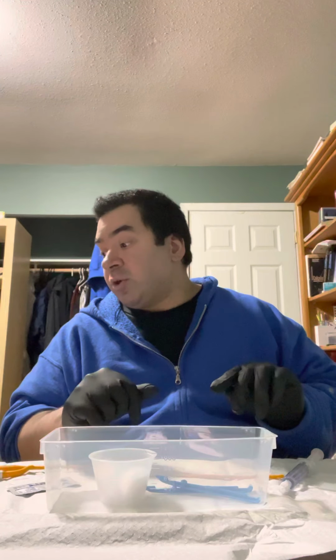I will not force the catheter if I feel resistance or if the patient feels any discomfort or pain. I will ask the patient to take slow, deep breaths to promote relaxation. If I have difficulty advancing the catheter, I'll hold it in place to allow the sphincter to relax. After the urine appears, I'll advance the catheter to the bifurcation of the drainage and balloon inflation port.